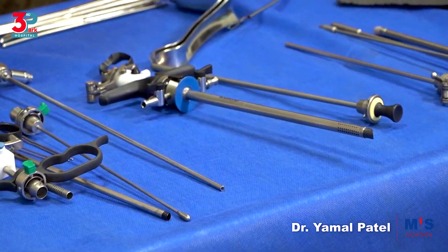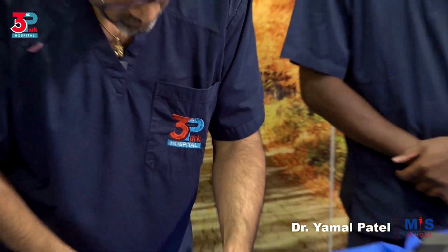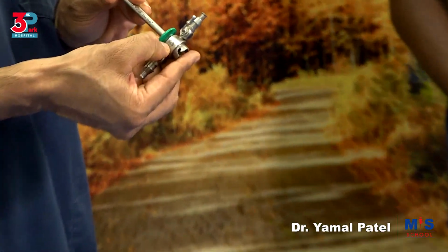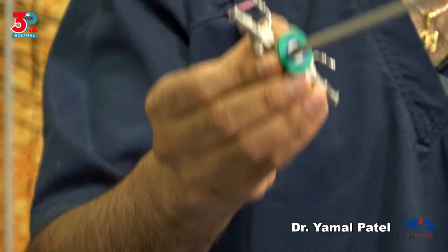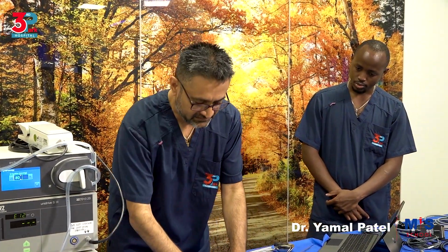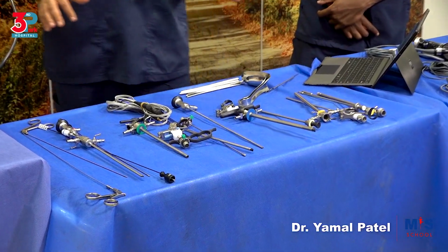But this resectoscope is a much smaller 6.5 millimeter, 18.5 French scope. So it is going to use a 2.9 millimeter telescope. These are going to use a 4 millimeter telescope.